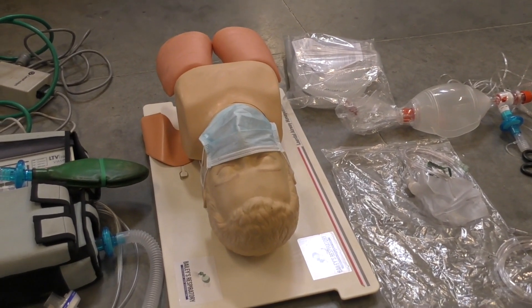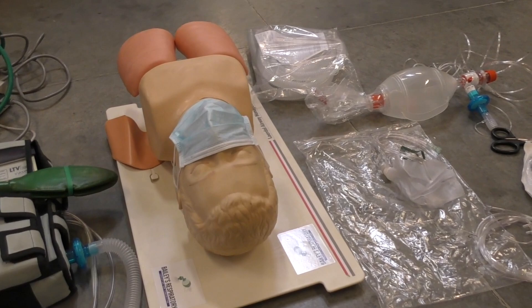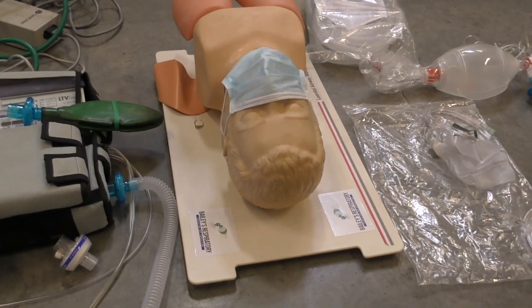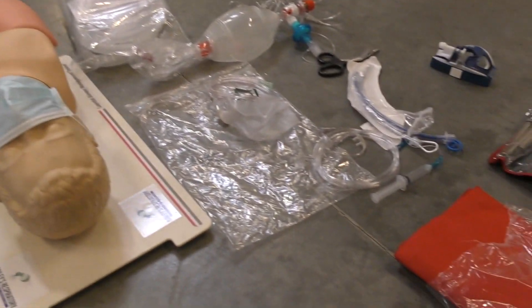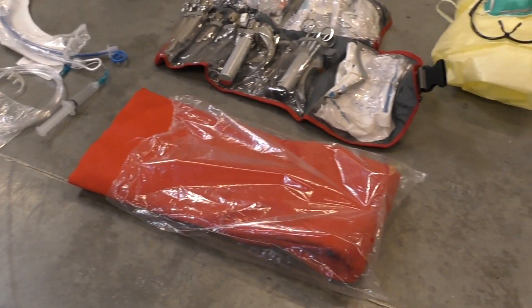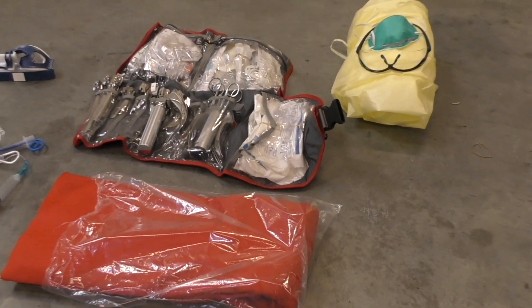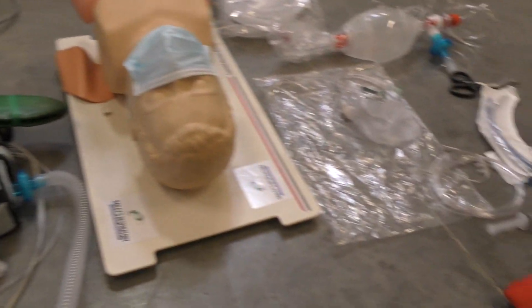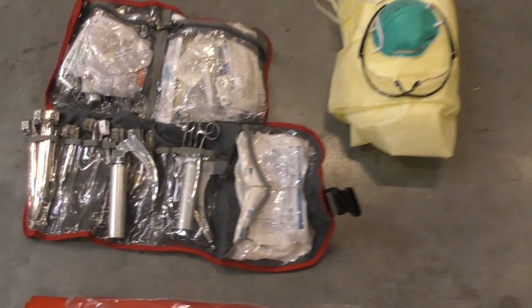We have our patient who is suspected COVID-19. We want to be very careful. If the patient is wearing a mask, go ahead and keep that mask on. We need extra barriers for this type of patient. The key is to be prepared before you get everything started — you don't want to just wing it. You'll notice I have everything laid out with our airway supplies.